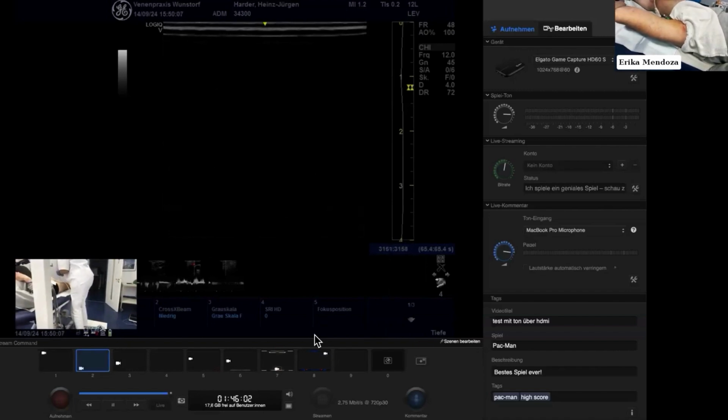And now I will go to the great saphenous vein where I have introduced another vascular access. In this case, I will just take the rest of it into the larger syringe, which is 4.5 mils.